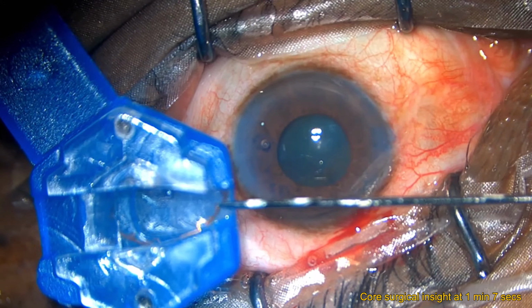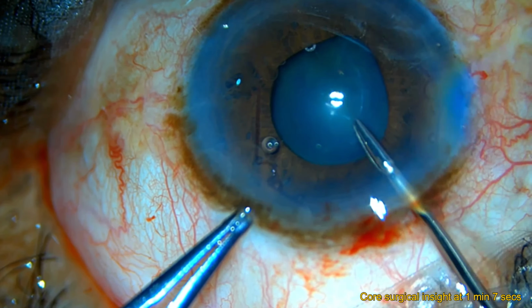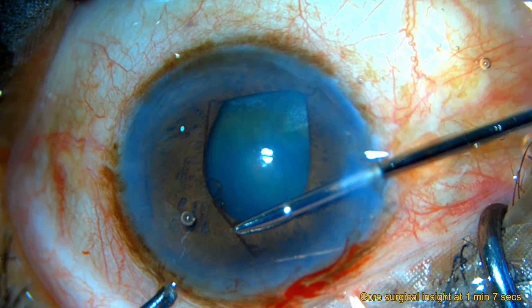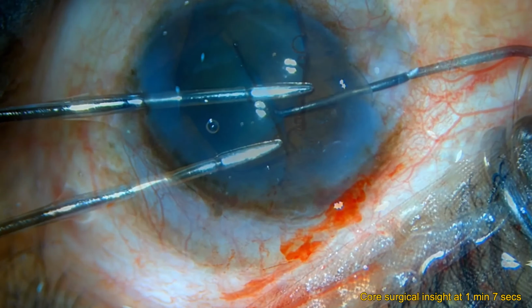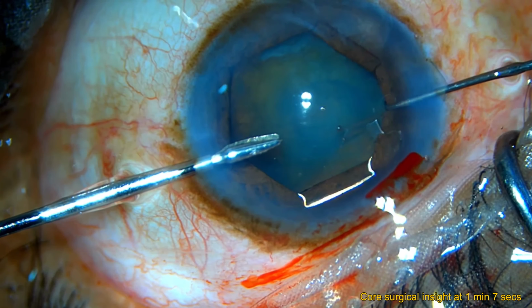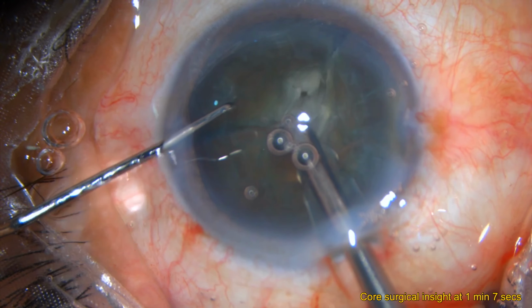But here's the truth, many of us haven't done the 2 plus 2 in our own heads. We don't really know why we are using those settings, we just assume that lower means safer. But in phaco, that might not always be true. In fact, lower settings can drag the surgery, increase manipulations, and ironically lead to more complications.